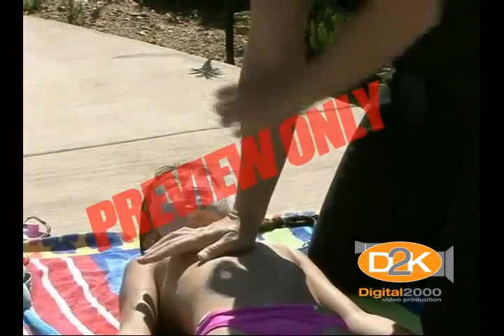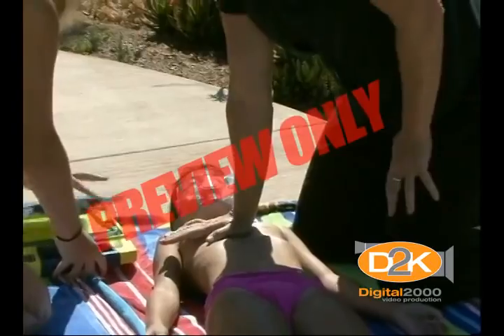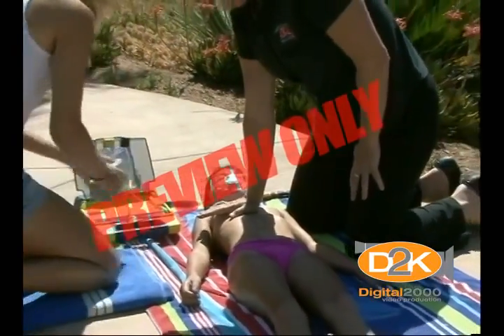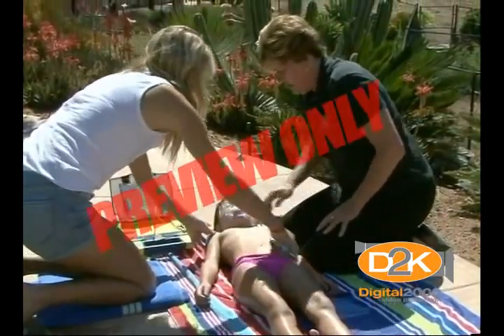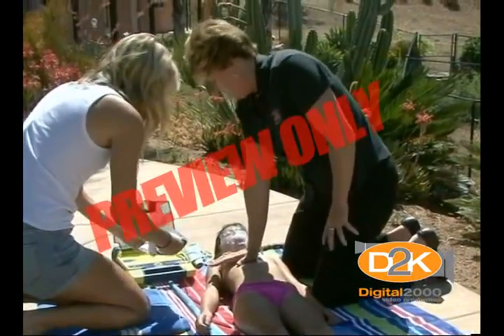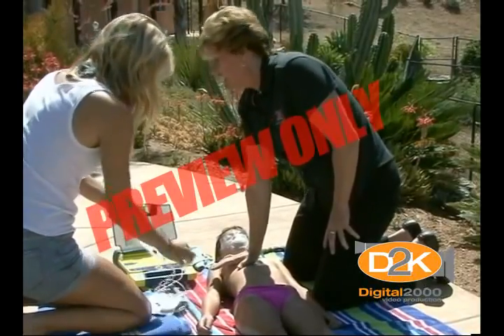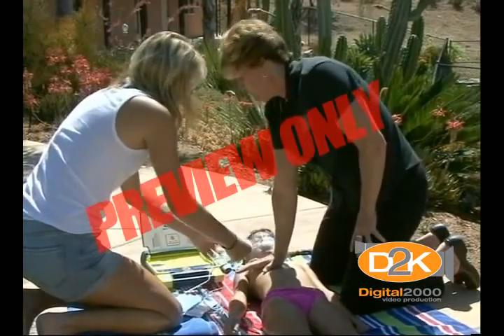Here's the AED. Oh, great. 911 is on its way. Great, thank you. Compressions continue. Can I wipe off? Good, great, thanks. 11, 12, 13, 14, 15, 16, 17, 18, 19, 20, 21, 22, 23, 24, 25, 26.